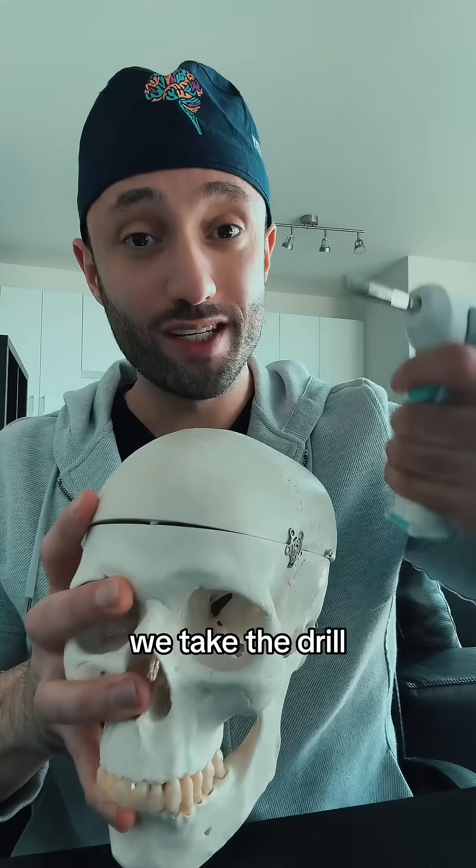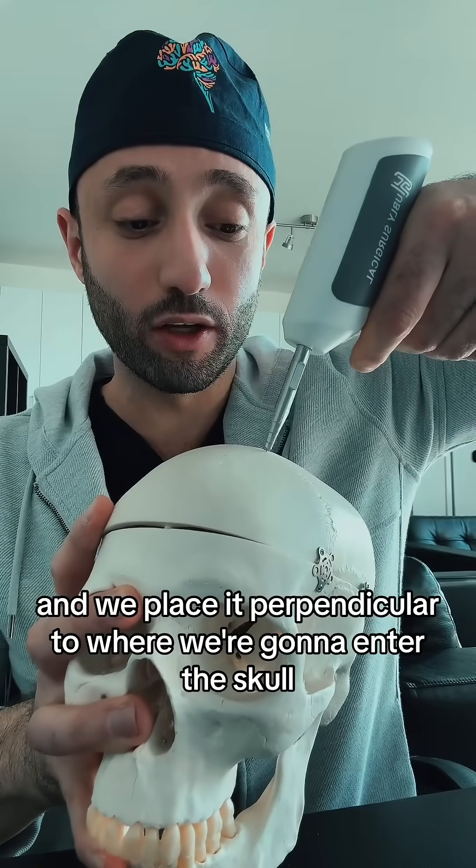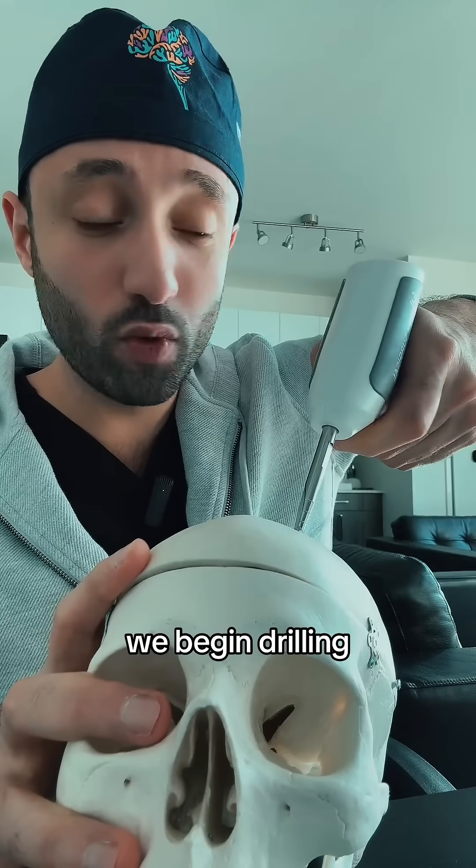Once we obtain our measurements and we mark the spot, we take the drill and we place it perpendicular to where we're going to enter the skull. Once we make our incision, we begin drilling.